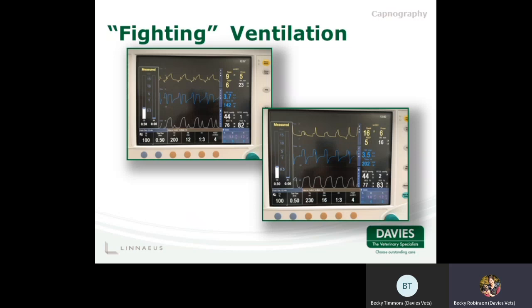The picture on the right was taken 5 minutes later and illustrates what has happened after I've made some changes to this patient's ventilation. I've now increased the tidal volume to 230 mils, so I have given the patient a bigger breath, and I've increased the respiratory rate to 16. The combination of increasing each breath and the respiratory rate, that overall increase in minute ventilation, has stopped the patient's drive to breathe. They no longer are trying to fight the ventilator.